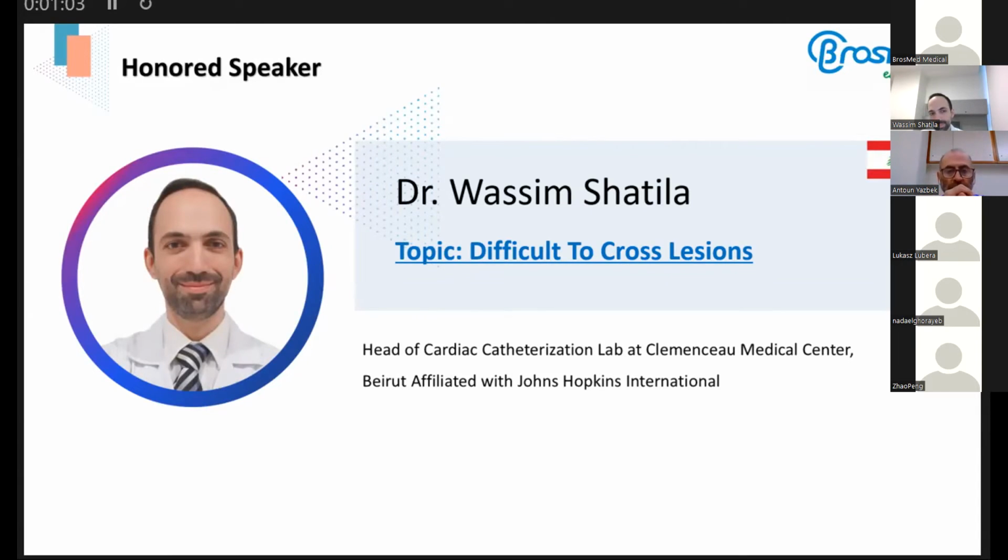Okay, thank you. But how do you find the situation when you have no other way but to go retrograde? And have you ever been in the situation when you have a balloon with too big an entry profile that you cannot even think about it? Yes. And now when you have this small balloon, would you consider to have more options during the procedure? I agree, especially when you're crossing through the septals and going all the way retrograde. I think this actually offers a huge benefit to help predilate those lesions and go from a retrograde approach. So yes, I think it's a huge change for us.